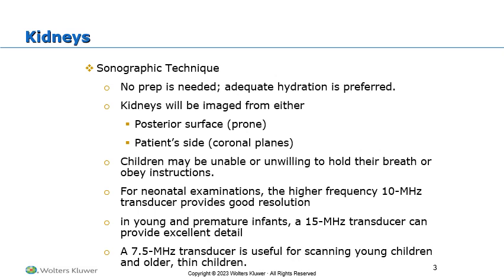For neonatal examinations, the higher frequency transducer that you can use, the better. These neonates are not going to require a lot of penetration, so usually you can get away with a high frequency transducer from 10 megahertz to even higher, oftentimes meaning that you're actually going to be going with a linear versus a curvilinear, which we really aren't used to for our abdominal studies.